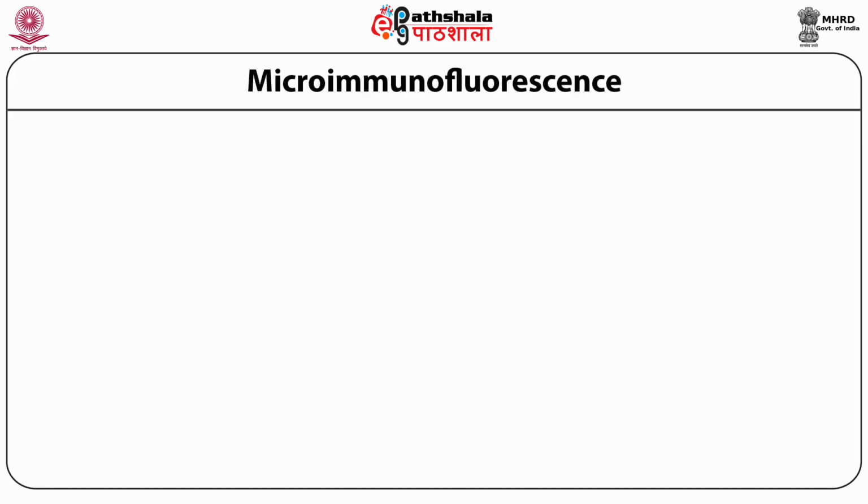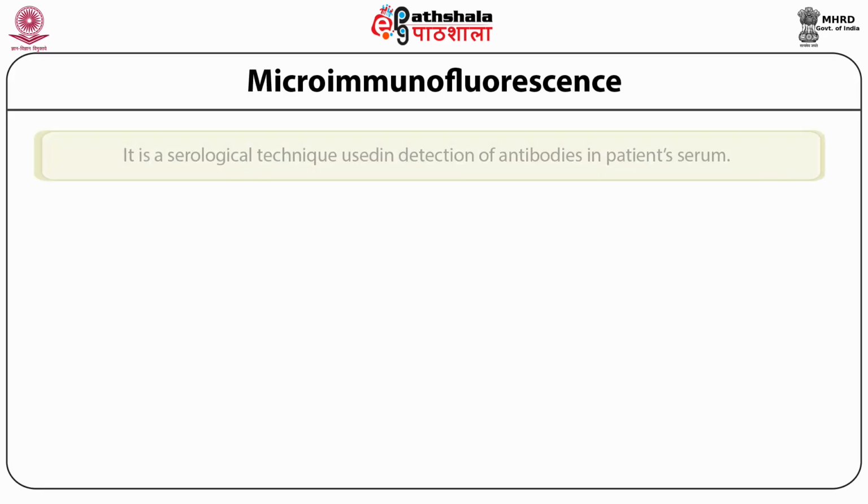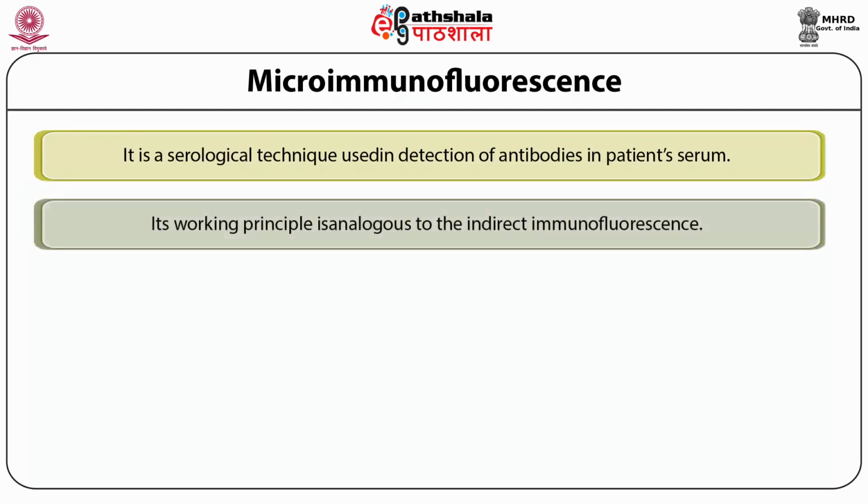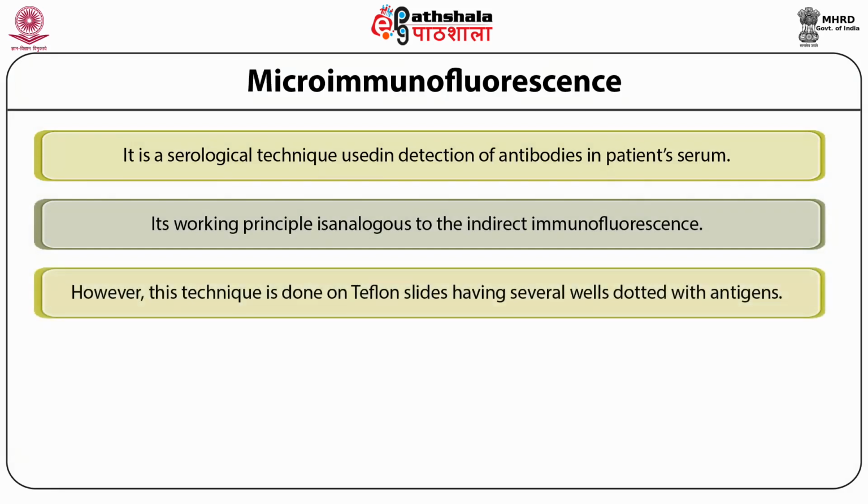We will next discuss microimmunofluorescence. It is a serological technique which is used in detection of antibodies in patient serum. Its working principle is analogous to that of indirect immunofluorescence. However, this technique is done on Teflon slides having several wells dotted with antigens.